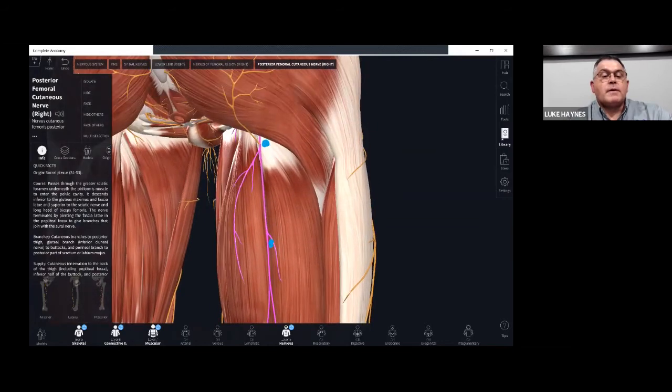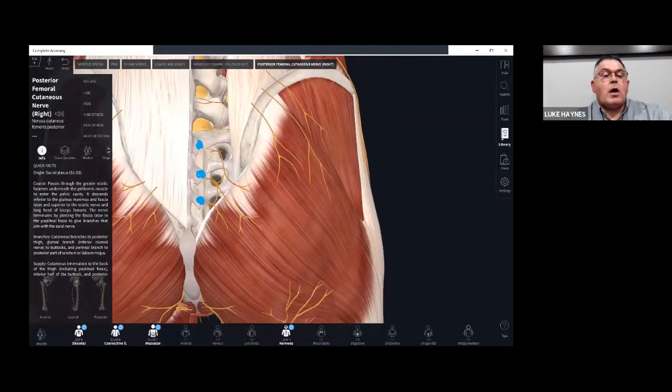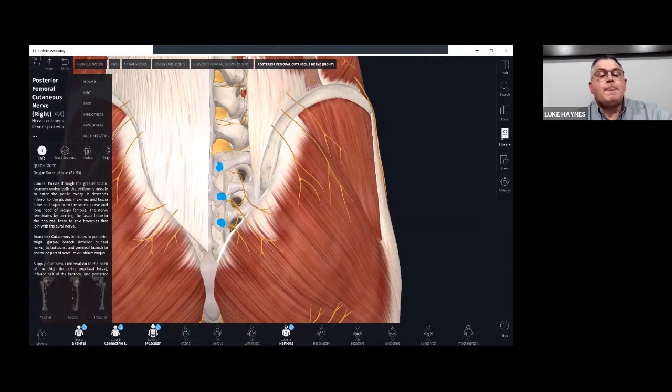But for posterior femoral cutaneous, because S1, S2, S3, we can also just needle onto the sacrum itself. We can find the PSIS, and we know here we are at S2, so we can come right above, at, and below the level of the PSIS.